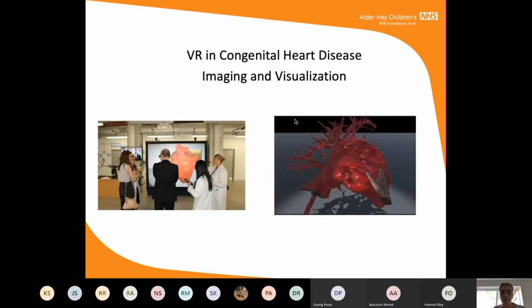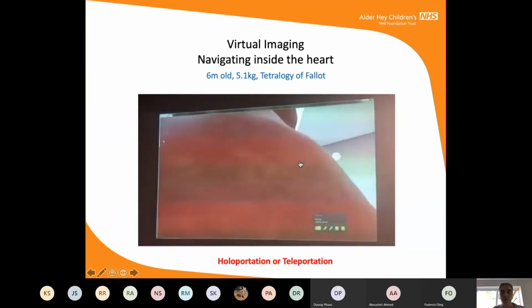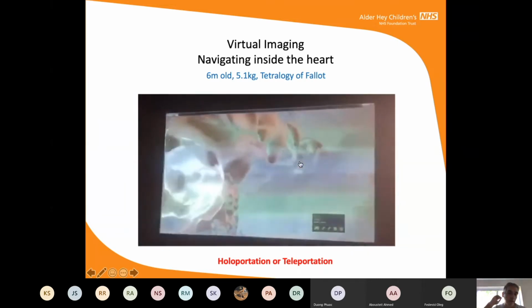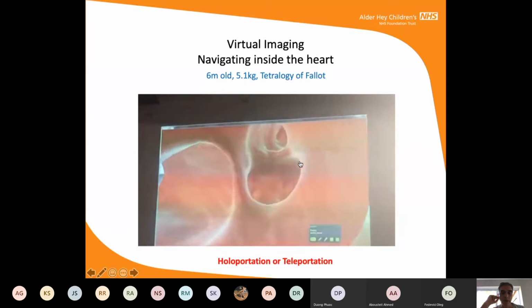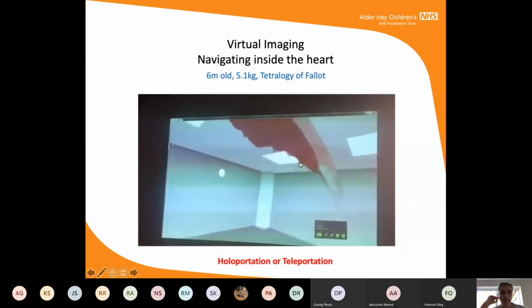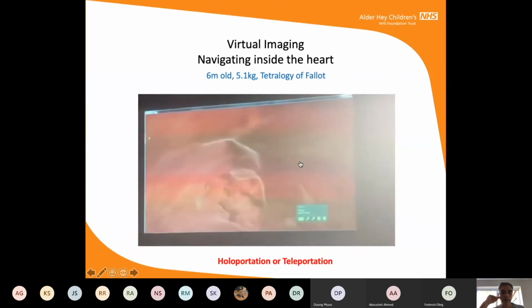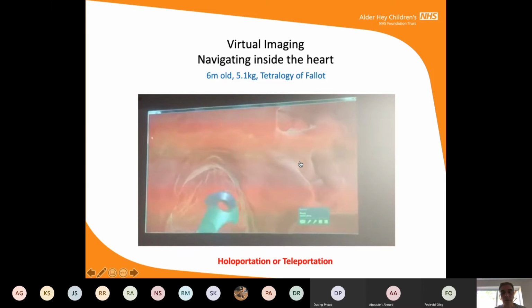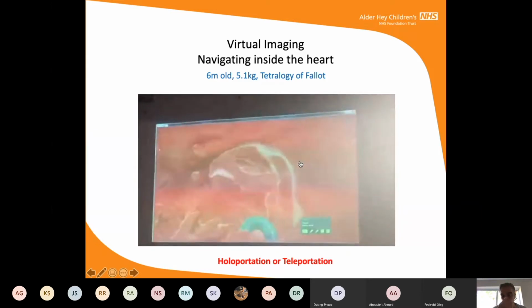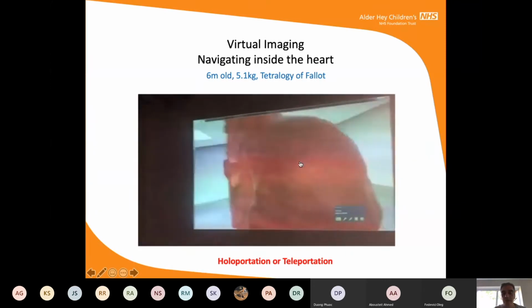In congenital heart disease, obviously, we were probably one of the first in the country, in the world, to do what we were doing, which, as you remember, was that we reconstructed a tetralogy of Fallot case, and we were walking inside the heart. We have had this for a few years, but it was difficult to progress because of several limitations. One was that reconstructing that heart from a patient took days and days. And it's not my area of expertise or any doctor's area of expertise. This is done by software engineers who are able to do this digital transformation. They haven't got a clue about the heart, so you needed to sit with them to make it as similar as possible.